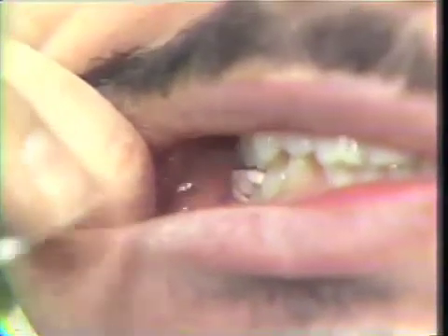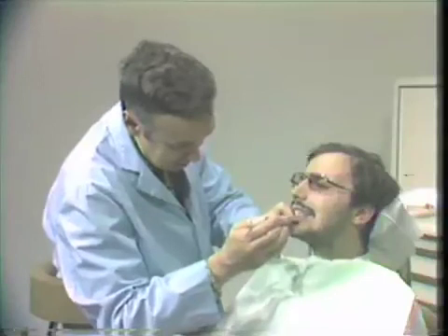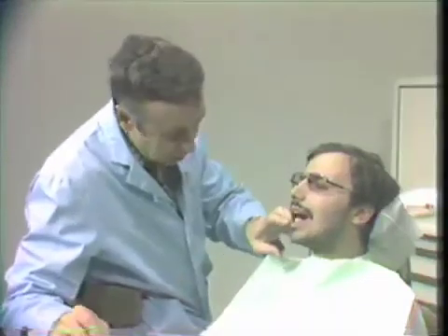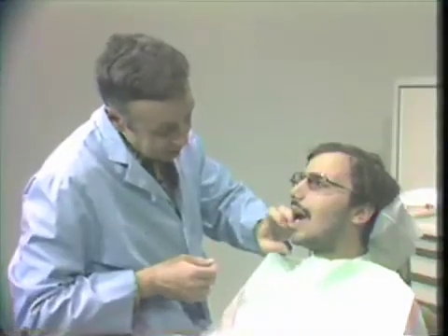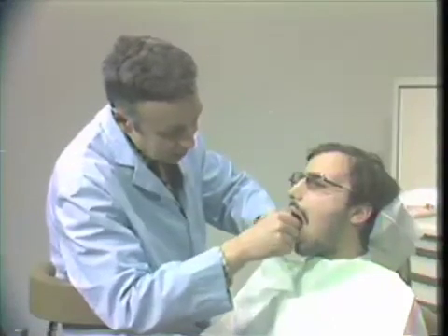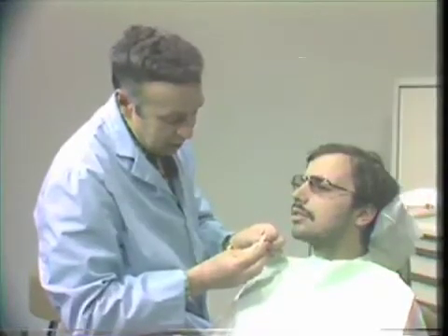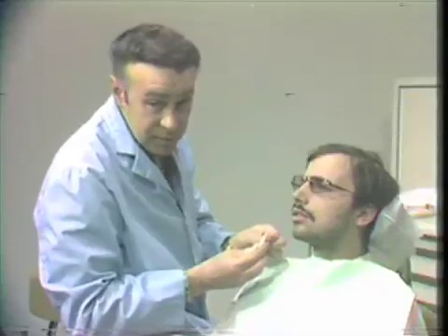Again, close please. And we'll go back over on the opposite side of the mouth and close together please, and check and be sure that we have maintained our contacts on the opposite side of the mouth. We can now apply our wax preparatory to doing our functional chew-in.